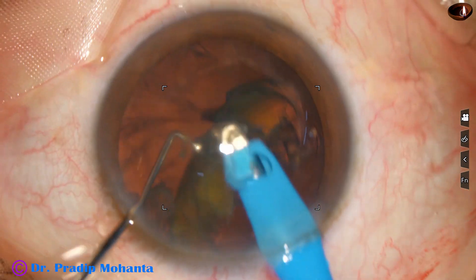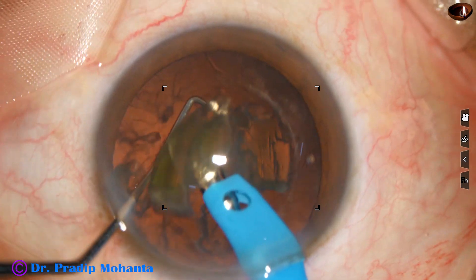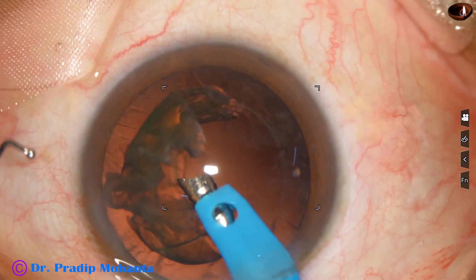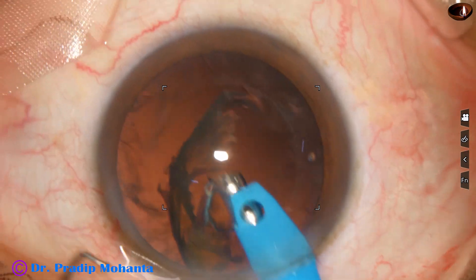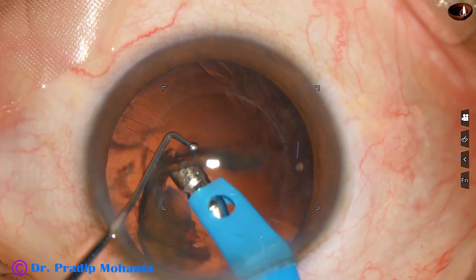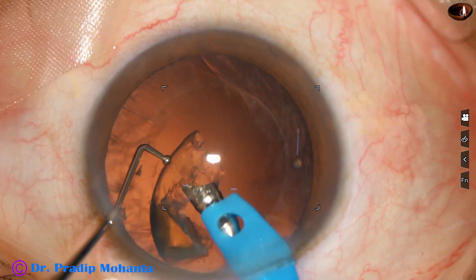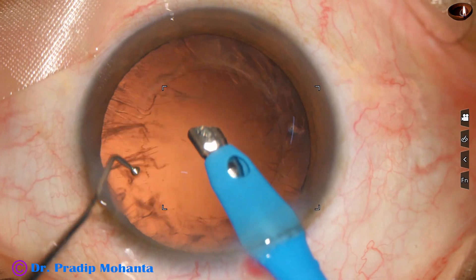These diabetic gummy cataracts just do not want to separate. But with the pre-chopper, it is not so difficult. With divide-and-conquer technique and with stop-and-chop technique, after making a trench, the posterior plate just does not want to separate or break. The nucleus is now managed.